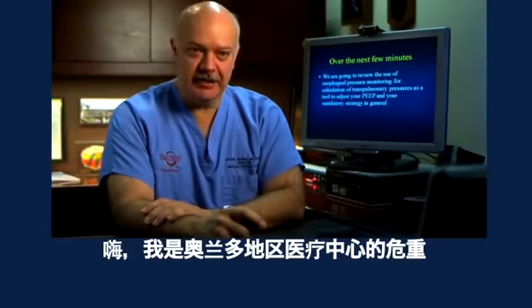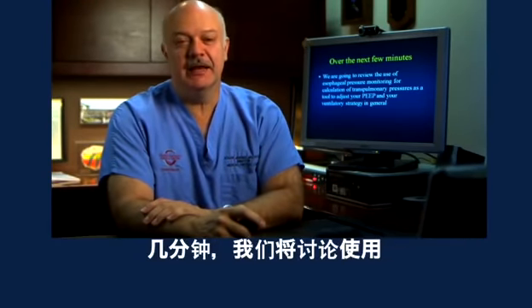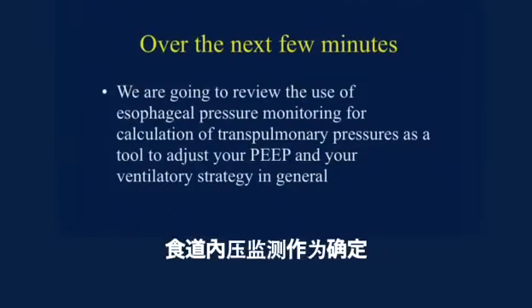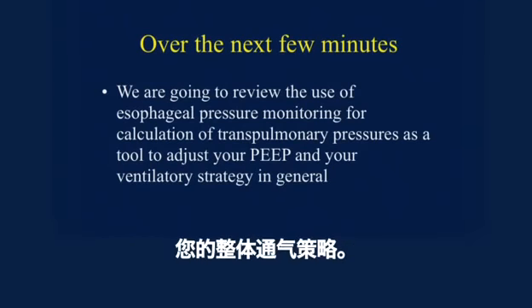Hi, I'm Dr. Edgar Jimenez, Director of Medical Critical Care at Orlando Regional Medical Center, and over the next few minutes, we're going to be talking about the use of esophageal pressure monitoring for determining transpulmonary pressures as a tool to adjust PEEP and your overall ventilatory strategy.